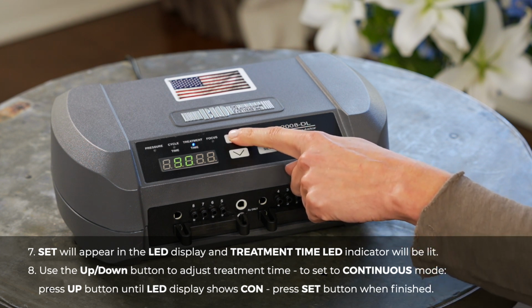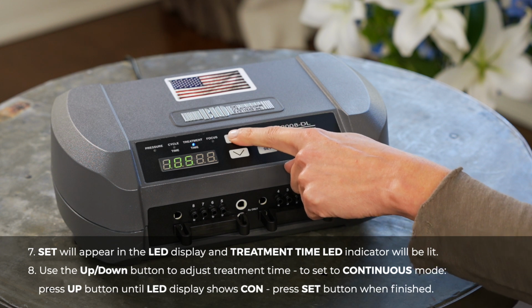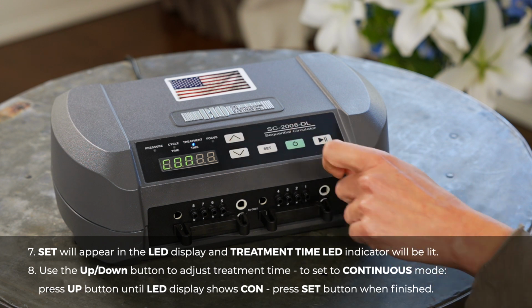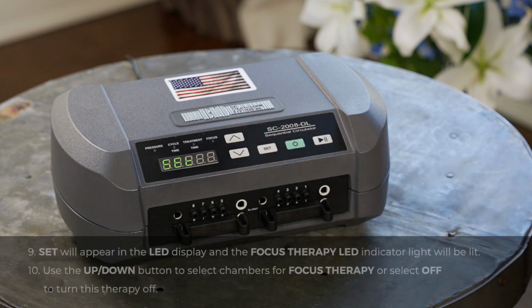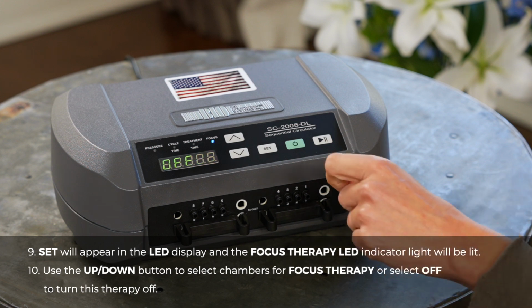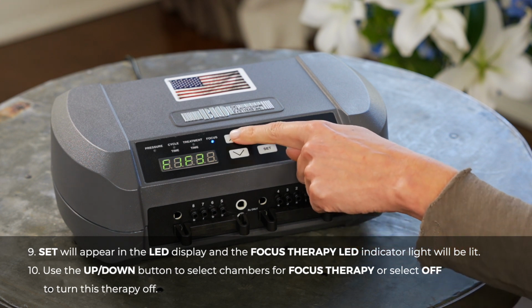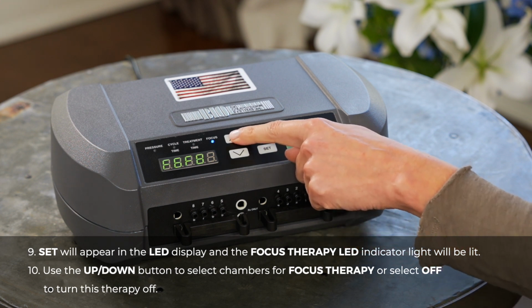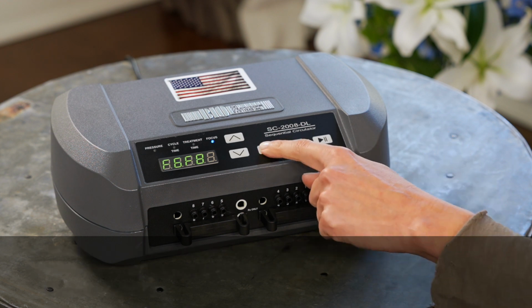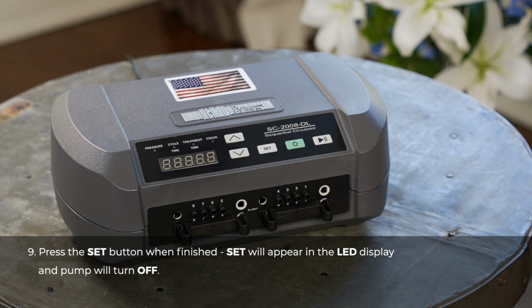To set up continuous mode, press Up button until LED display shows CON. Press Set button when finished. Set will appear in the LED display and the focus therapy LED indicator light will be lit. Use the up-down button to select chambers for focus therapy or select Off to turn this therapy off. Press the Set button when finished. Set will appear in the LED display and pump will turn off.